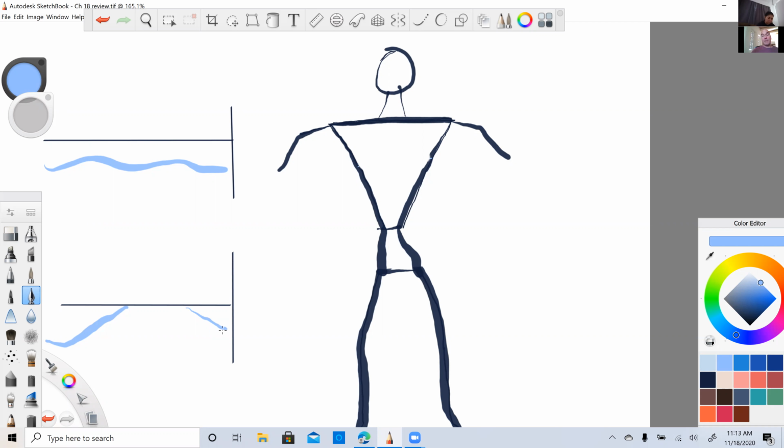Okay, I have to remind myself, I have to quickly look because I honestly have a really hard time keeping this in my memory. This is tricky. Let's see, green is going to be baseline diaphragm, neither breathing in or breathing out, just kind of in the middle. Purple is going to be inspiration.